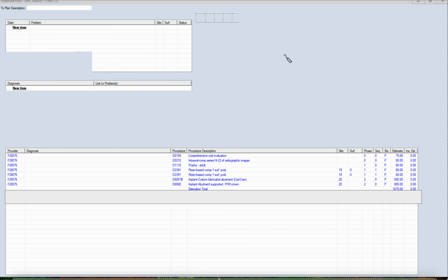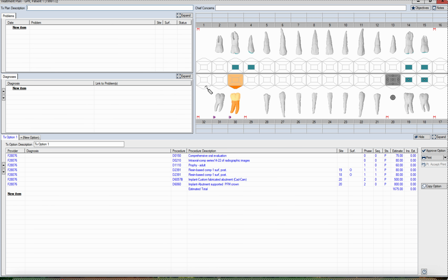So look now, we updated this picture. We've got just an exam, the x-ray, the cleaning, these 2 little fillings to be done. This space is not bothering him. These teeth have shifted over. We're just going to leave it. Patient is not interested in a bridge and it's okay to do this implant.